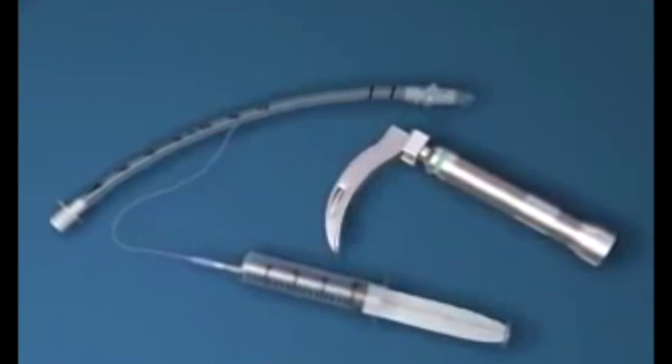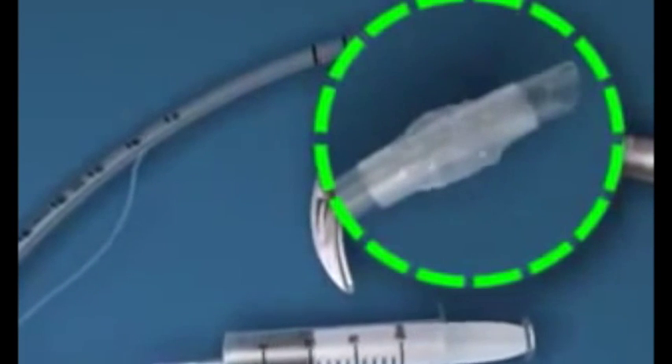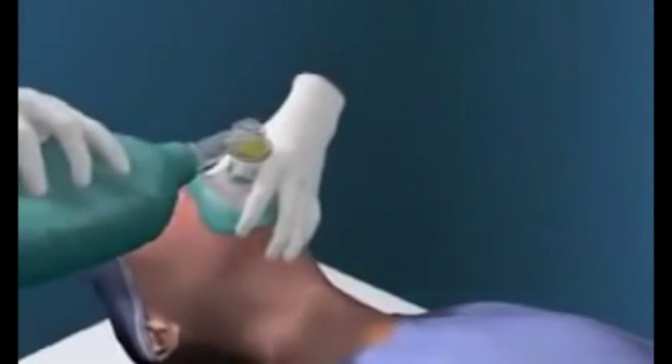Ensure that the equipment is prepared and check that the laryngoscope is working and the cuff on the tube inflates and deflates properly. Pre-oxygenate the patient with bag and mask ventilation for up to one minute before attempting to intubate.